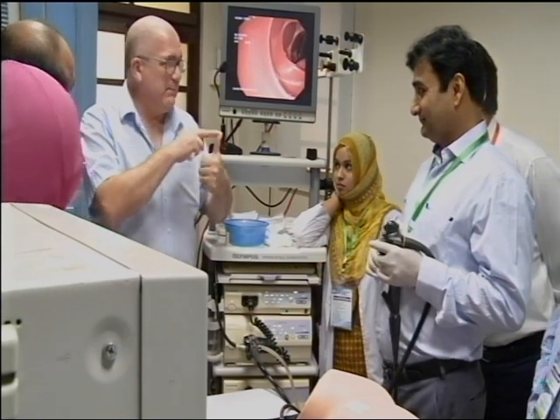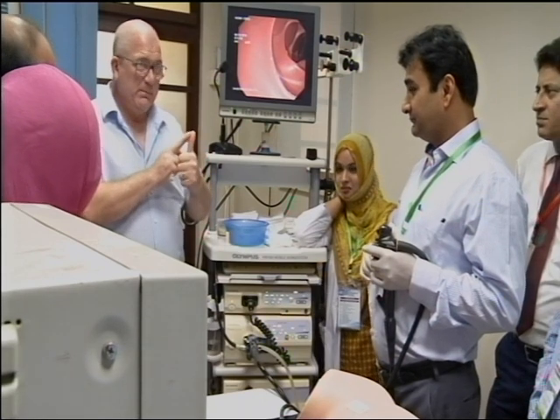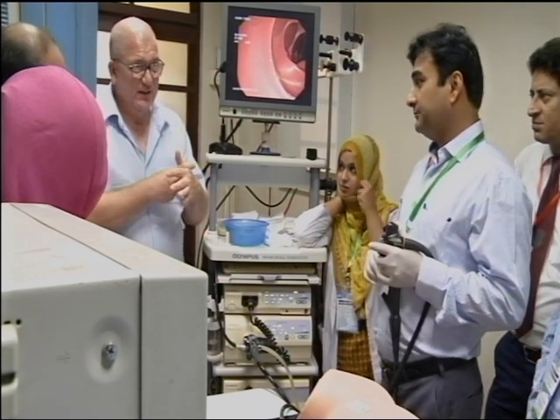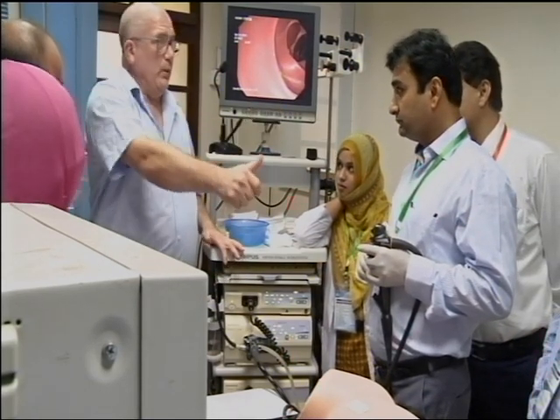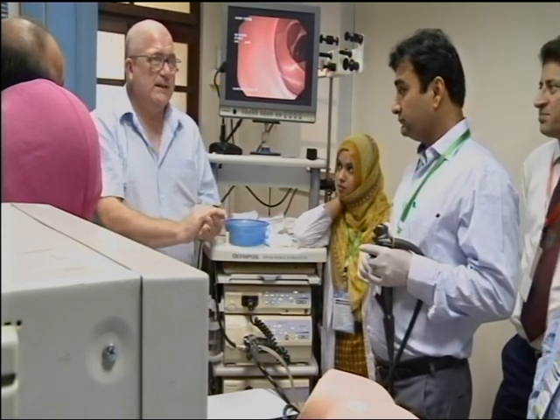I hate surprise attacks. Any surprise attacks, and you will hear me going, "What the hell are you doing, man?" So, what are surprise attacks? Surprise attack, you went in with the scope very quickly. Whoa, that's a surprise attack.